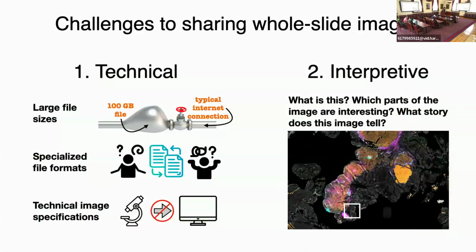Last thing I want to touch on is Minerva. So if we want to promote the image itself as a useful and critical data artifact, then when we go and publish papers and share data with the world, we want to be able to let them see those images. So just a tiny little thumbnail of 1 of 20 tissue samples in figure 2B of your paper is not going to cut it. So let's just share the data with everyone.